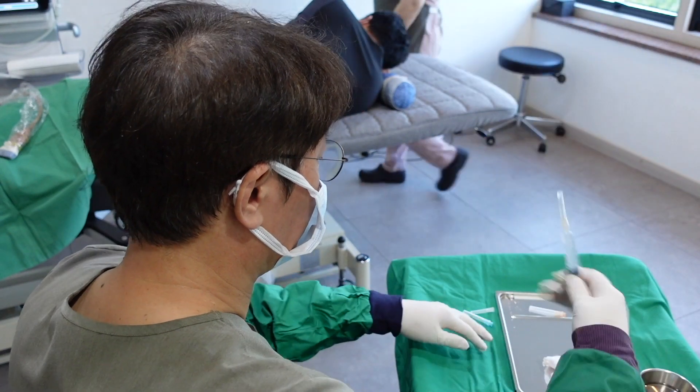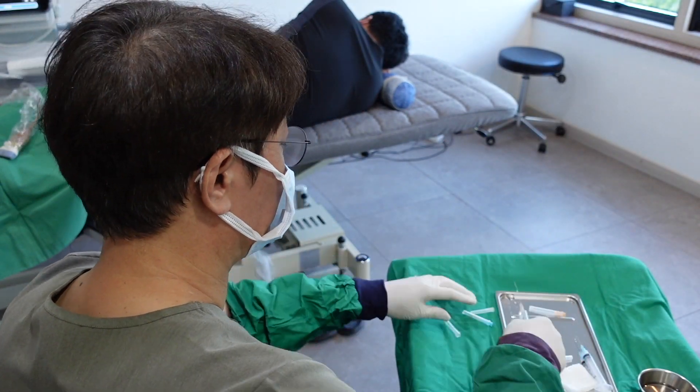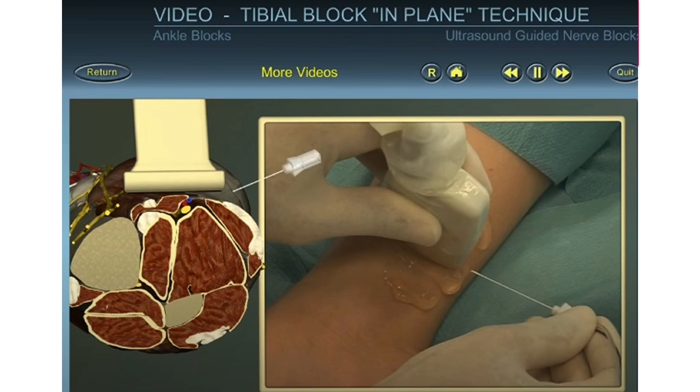Shaking and eliminating air bubbles is an essential step. When it comes to block level, many doctors prefer a site higher than the medial malleolus.